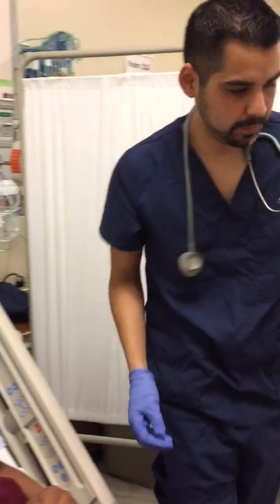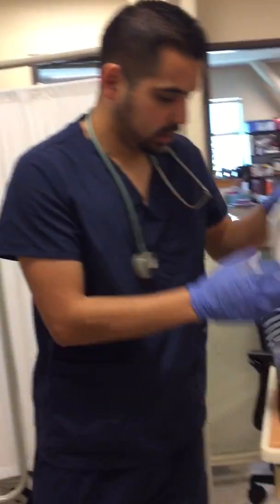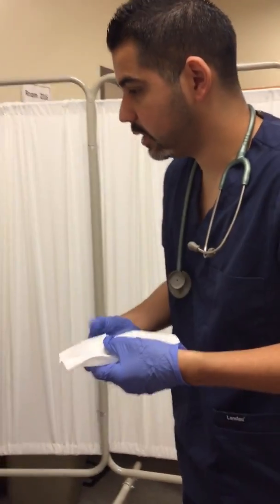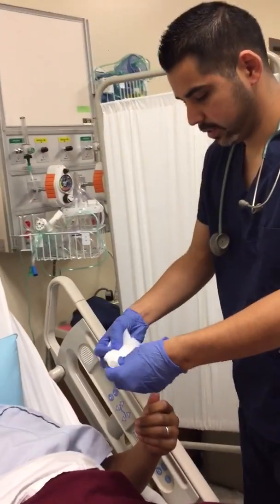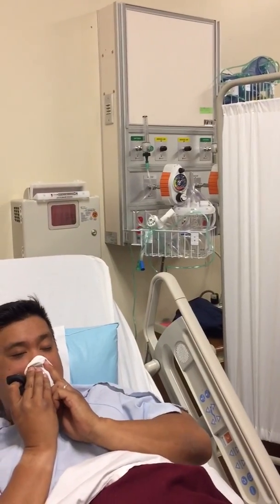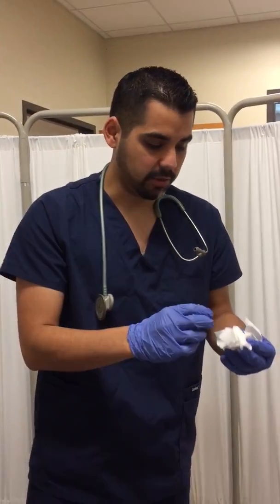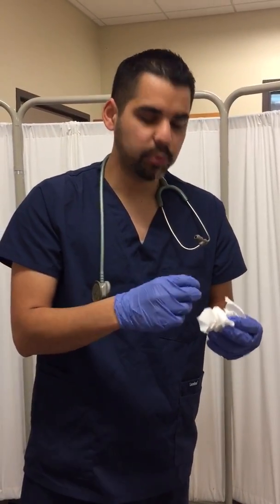All right, Richard. Now we're gonna be doing some vital signs again. But before we do that, we're gonna be asking you, can you cough up anything one more time? Good, very good. I will make note of if anything came out or if nothing came out. Right now, a couple things came out, and actually, that's pretty good. That means the drug is working.